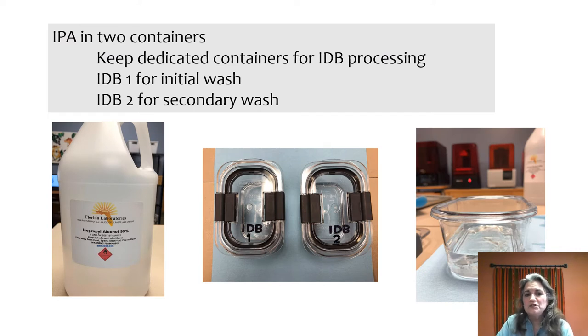We like to use 99% IPA, but we keep it separate. The IPA used for the indirect bonding resin should be kept separate from what's used for your other resins, because the indirect bond material is approved for intraoral use — there's a biocompatibility requirement there — whereas the resins you're using for your models probably aren't.